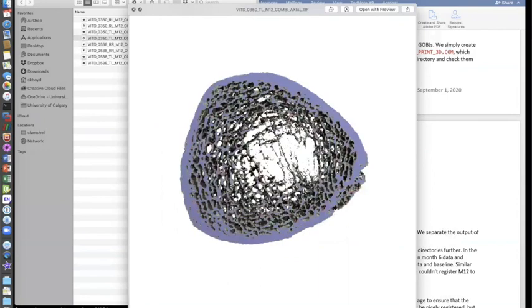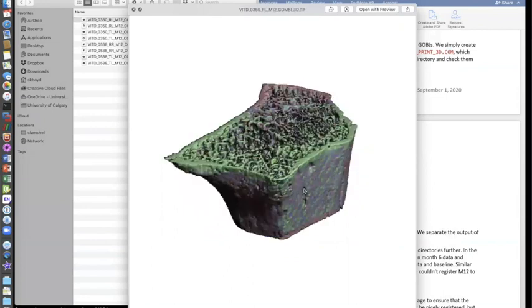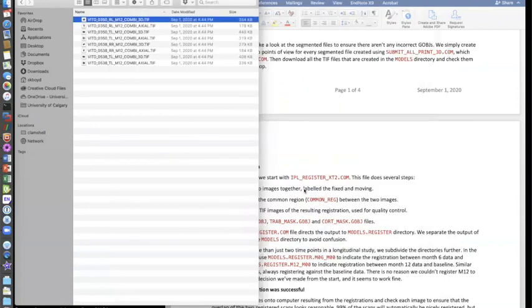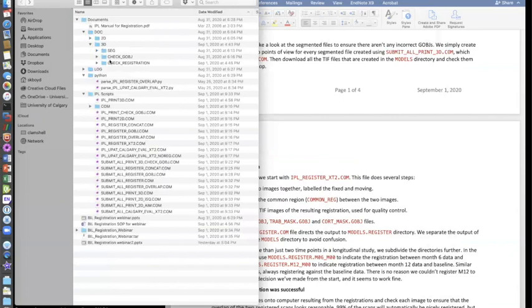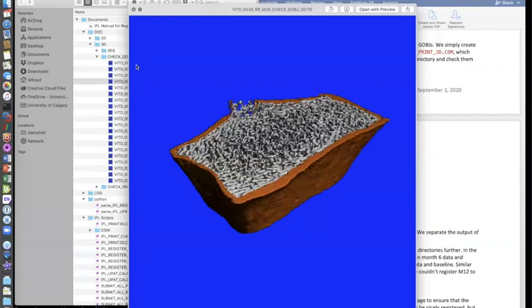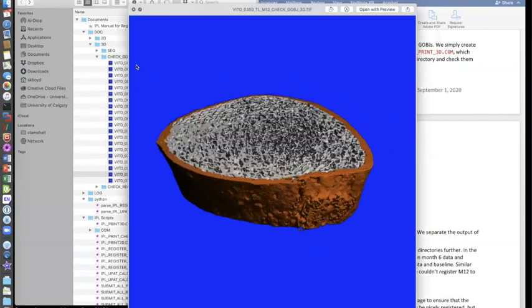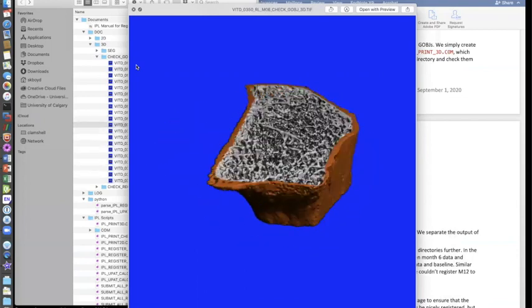And when I say misaligned, I mean one is 90 degrees to the other. Sometimes strange errors happen like that. But I'll create all those images and check every single one in the series. It's really important. I'll also check the segmentations after. And again, ugly colors, but the point is just to be able to literally do what I'm doing right now, flick through really quickly and look for obvious errors.